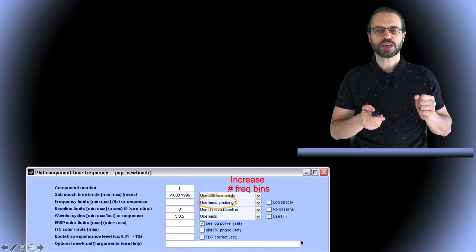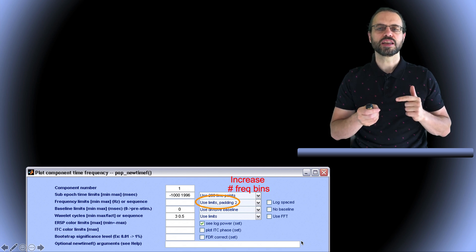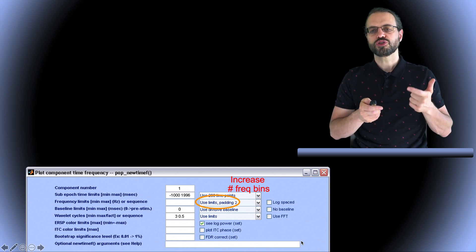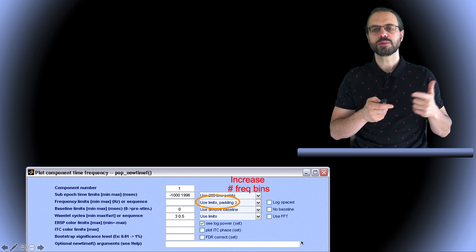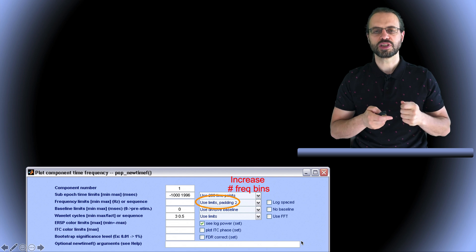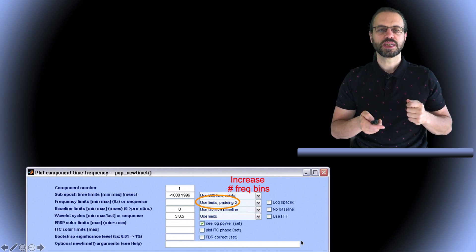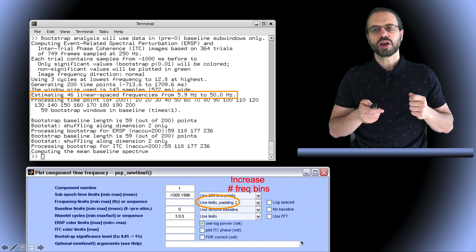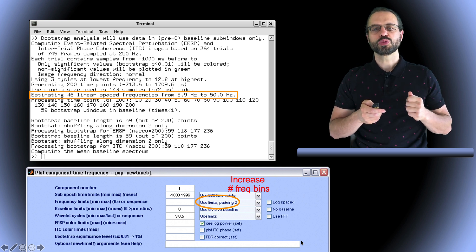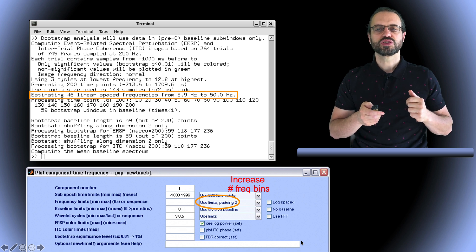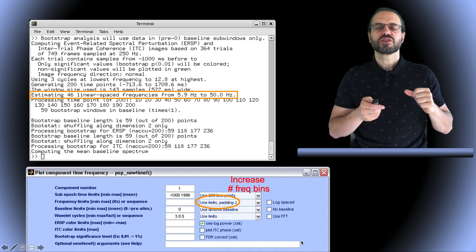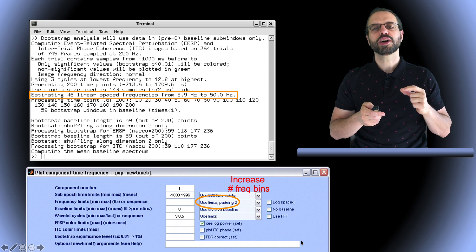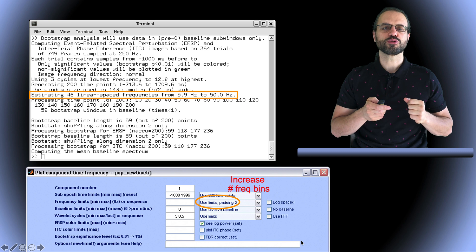As for the spectrum, you can also change zero-padding. This is usually only valid when using Fourier transforms, but when you use Wavelet, the function simply increases the number of frequencies, as if you were using a Fourier transform. So for this function, we use what we call the pad ratio parameter, which simply multiplies the number of frequencies. So in the previous slide, we had 23 frequencies, so if we have a pad ratio of 2, we have twice the number of frequencies, in this case 46 instead of 23.